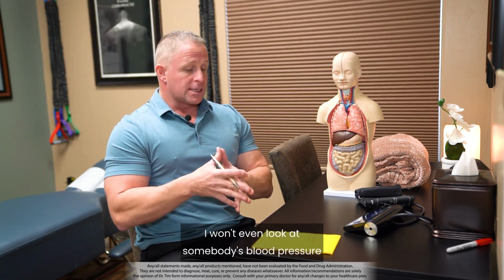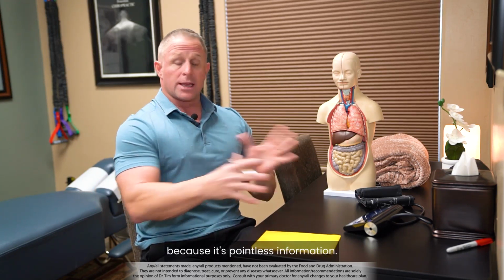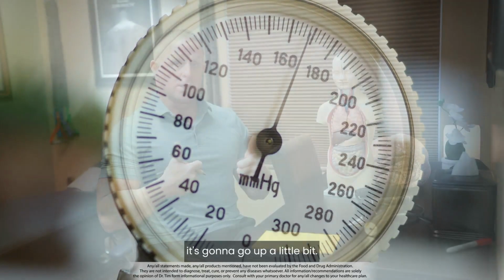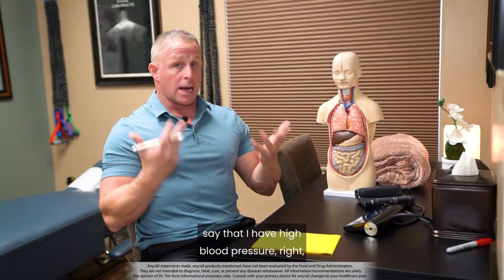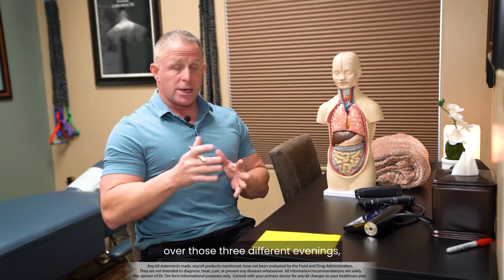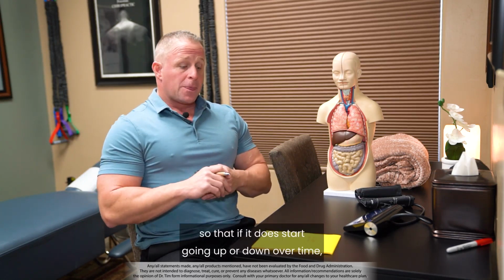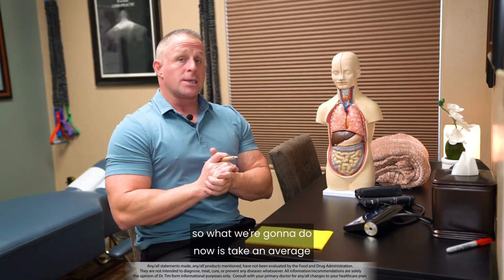I won't even look at somebody's blood pressure if it's not in this structured way, because it's pointless information. Your blood pressure literally changes every 30 seconds. If I get up and again walk to the bathroom right now, it's gonna go up a little bit. Obviously, I don't wanna take my blood pressure, and if it's elevated, say that I have high blood pressure, right? That doesn't make any sense. So getting these 9 measurements over those 3 different evenings, it's just a great way for you to keep track of your blood pressure so that if it does start going up or down over time, you're gonna be aware of that.